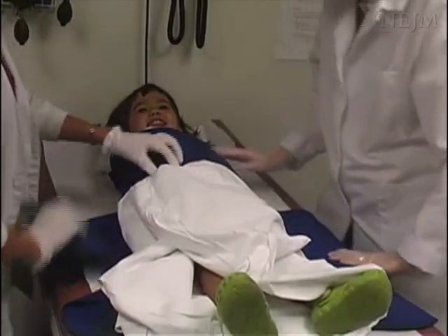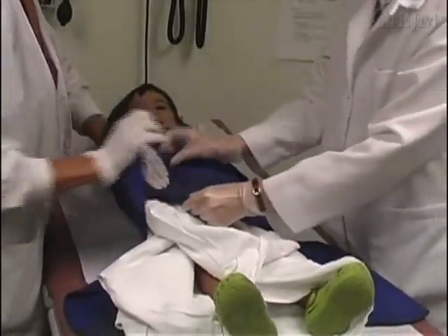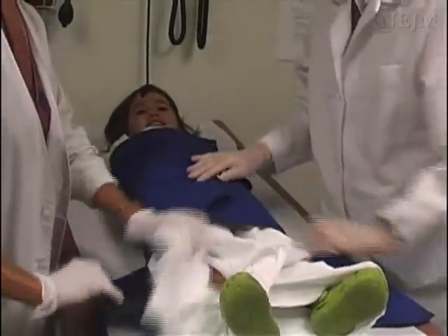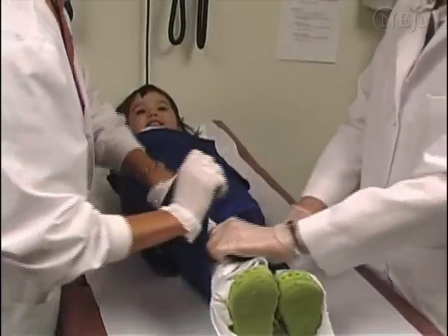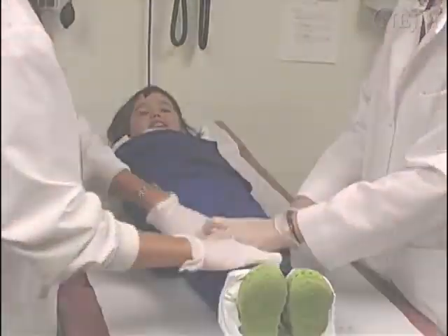First, fully immobilize the child in a papoose board and secure the child's head. Cerumen should be removed before you begin the procedure.